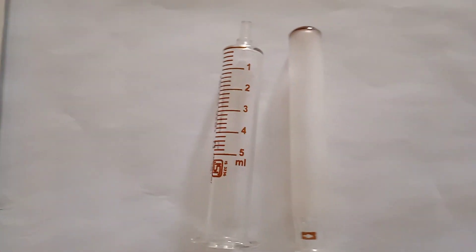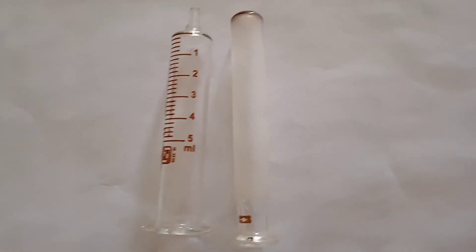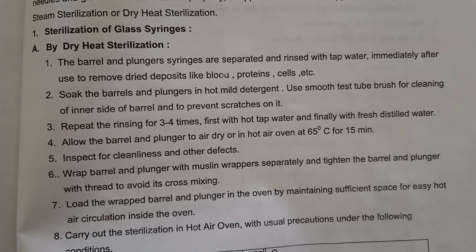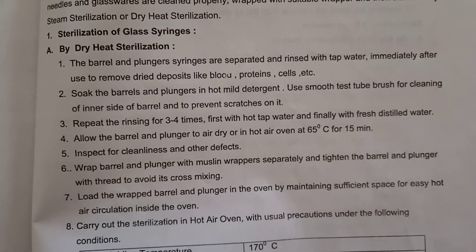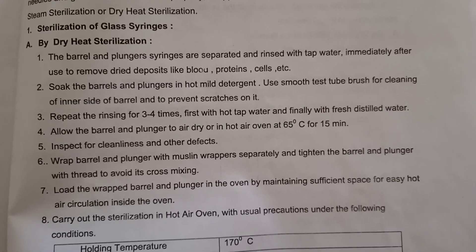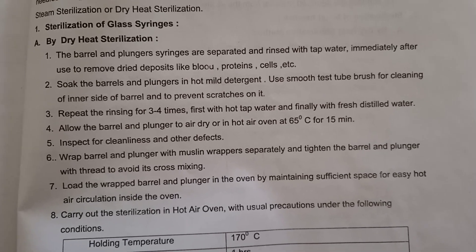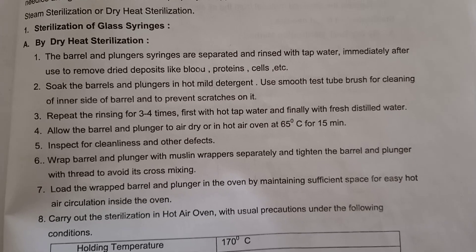We have to sterilize these glass syringes by dry heat sterilization method. Sterilization of glass syringes is done by two different methods: dry heat sterilization and moist heat sterilization. For all different types of sterilization of the syringes, glasswares, needles, measuring cylinder, and round bottom flask, the procedure is the same.